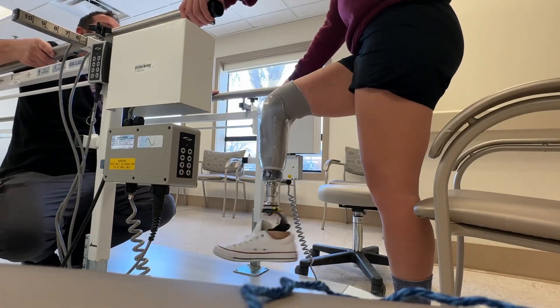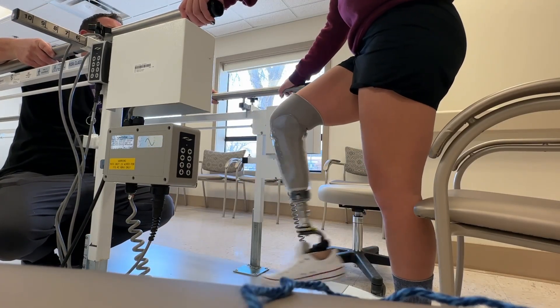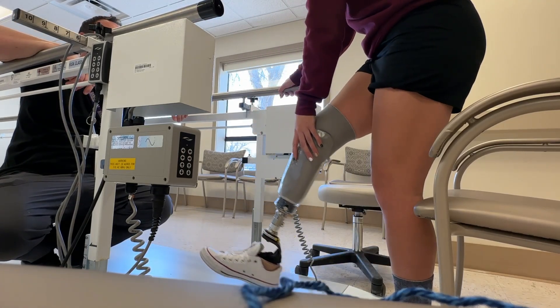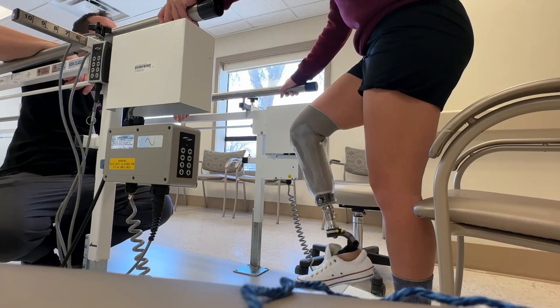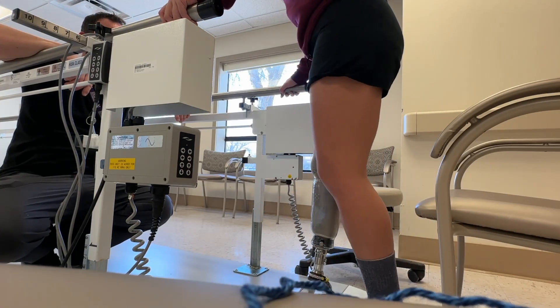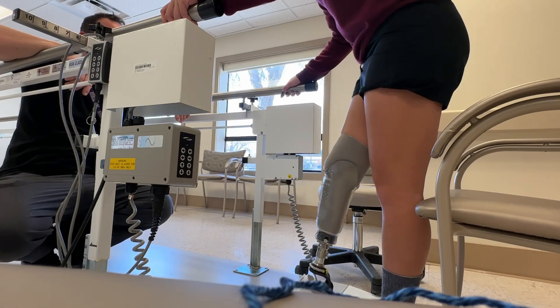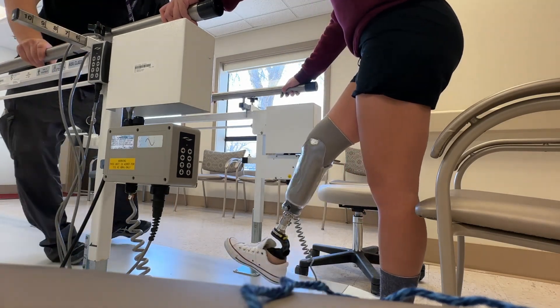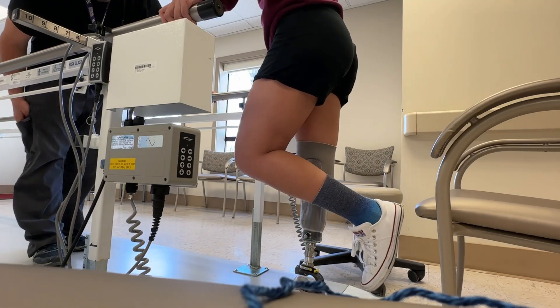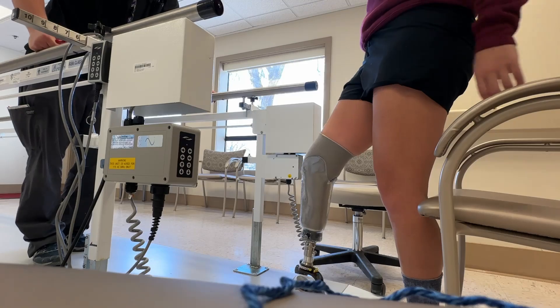It helps to kind of lock a little bit tighter. It's feeling loose? Yeah. Loose everywhere? Loose just up top? Loose up top. How is it down at the bottom? I think it's okay down at the bottom. Your alignment was off. Maybe that's just how you're testing. When you step, it's like you're doing this.